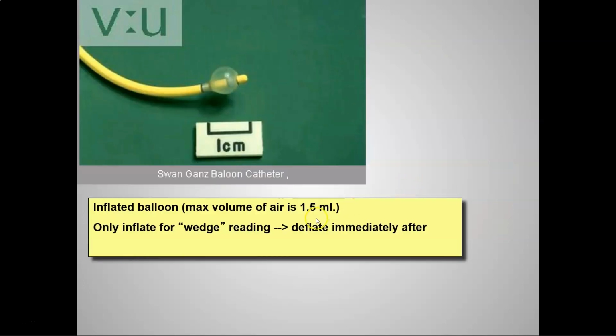Okay, I already showed you this. Here's our little baby balloon. It's actually smaller than I stand corrected. I believe I said 1.5 centimeters earlier. I stand corrected. I believe it's 1, and my metrics were off, and my mLs are 1.5. I do apologize for that. So that balloon, and it's not even a full 1 centimeter, so much as the tip of inflation is 1 centimeter. But look at that balloon. It's just a little baby balloon.